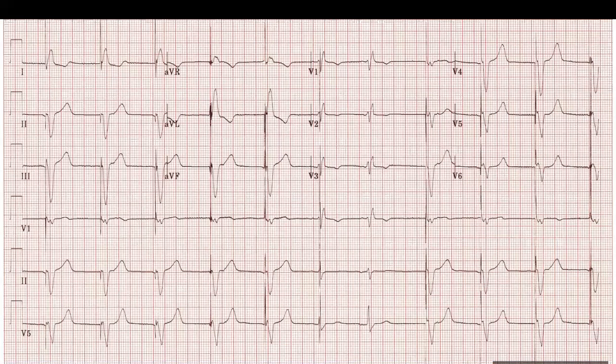No, I failed. Okay, when I go here, there is something here, and there is something here. Especially in the second one, you can see it a little bit more clearly. There might be sinus activity, but you can't see it in the rest. So this patient might have sinus node dysfunction. So there is intermittent sinus node activity.